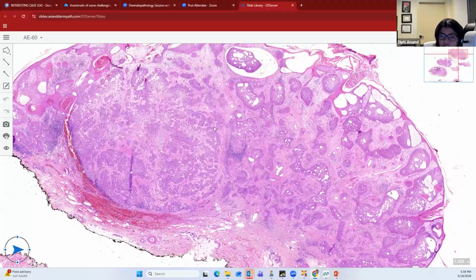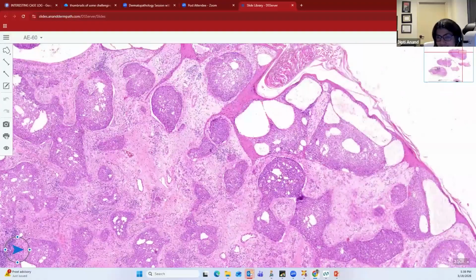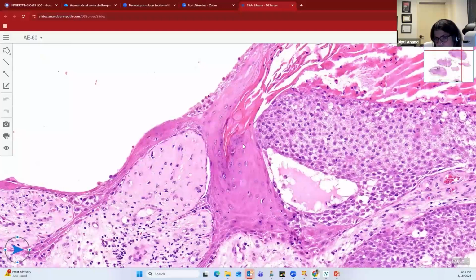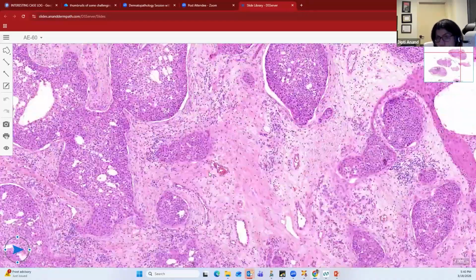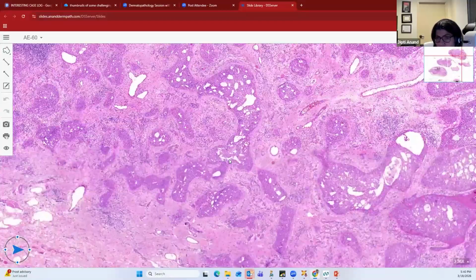So how do you recognize something to be a porocarcinoma? The first time you see this tumor, you will always think about a squamous cell carcinoma. But the difference is that these are poroid tumors, so they will have a sharp connection with, and delineation from, the epidermis. You can again see the sharp demarcation, the larger cells and the poroid cells. But now it is malignant, so these cells will be more atypical. You will see the infiltration, and you can see the nice invasion into the dermis.